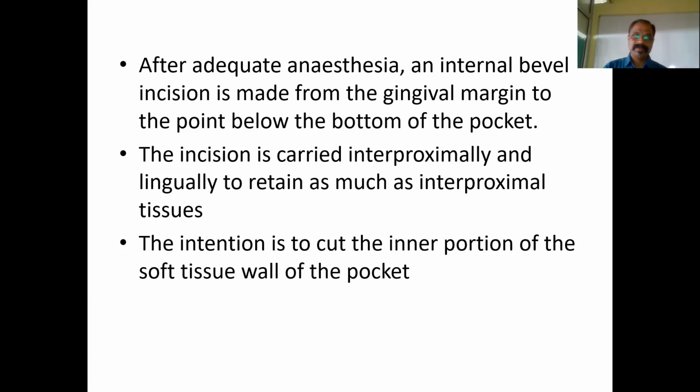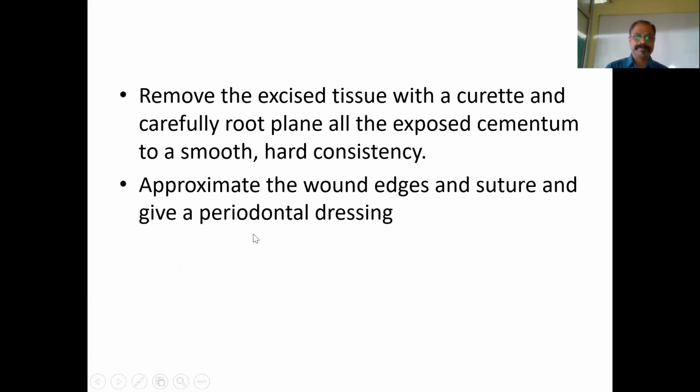This is the difference. In a curettage, you take a curette and scrape out the soft tissue wall. But here, in an excisional new attachment procedure, you use a knife or scalpel blade, and the intention is the same: you try to remove the soft tissue wall of your periodontal pocket.